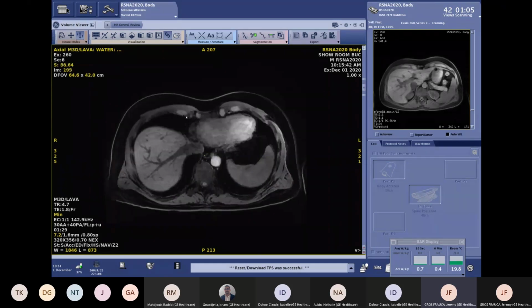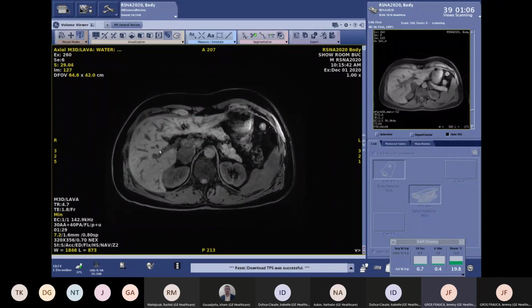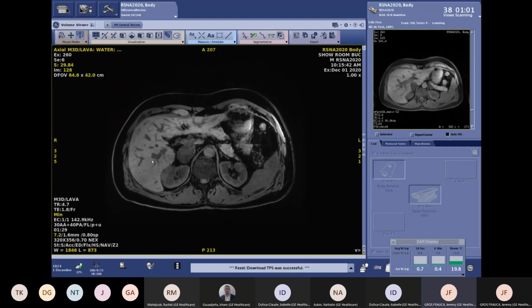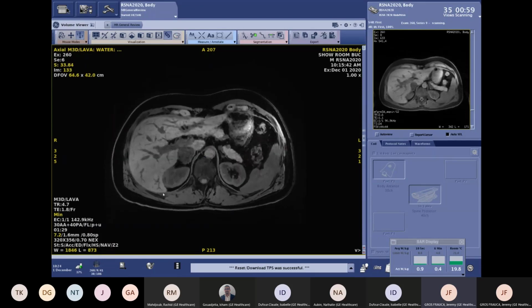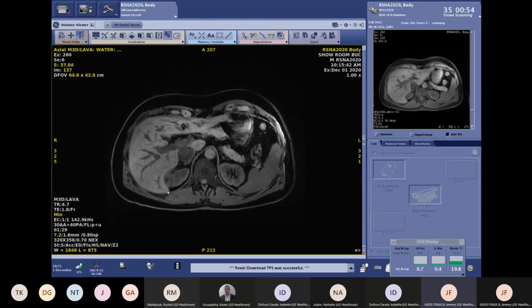Yes, thank you, Rashid. So yes, just this one, Navigator 1. So I use a minute just to let you taste how the in-plane resolution is really good, and how the details that you have in the liver on this one. This is for the free breathing.